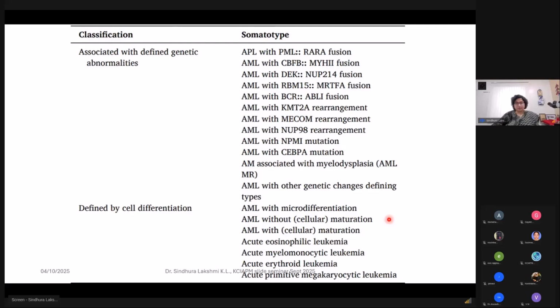The classification which was described earlier is the 2017 classification, which you had given, Dr. Pallavi. It is from 2017. Now, 2017 is superseded by the 2022 edition, that is WHO HEME 5. There is another classification called the International Consensus Classification given by another group. Either of them you can follow, or both, when you're reporting, but classifying the disease based on an older classification when a newer one is available is not recommended.